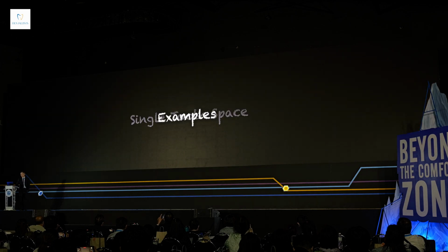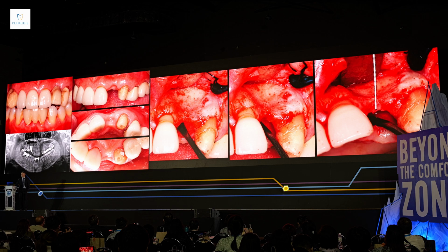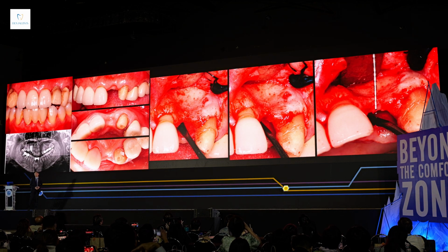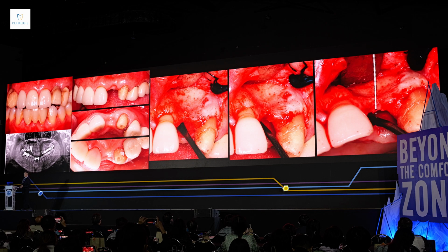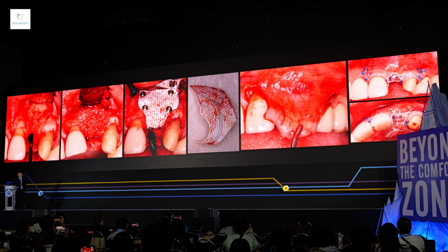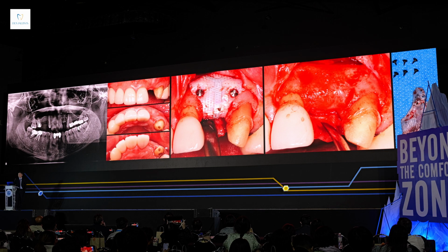So I'll give you this example. A single tooth space. When the patient came to my office, apparently it was maltreated. There were malpositioned implants, and of course the edentulous site was atrophic, with loss of buccal and coronal, vertical and horizontal bone. It's a single tooth space. I decorticated, put in the bone and a non-resorbable membrane, and put the tissue back, closed it up, and sutured it.